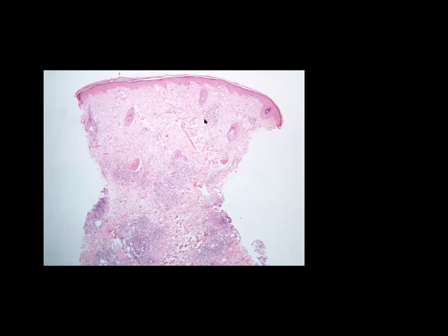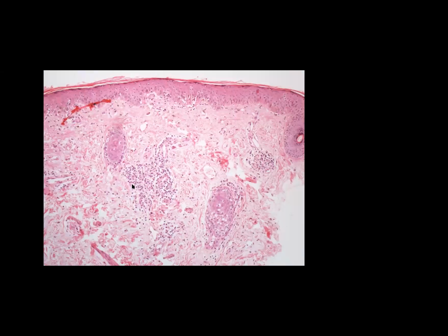We can see this perivascular and periappendageal infiltrate in the superficial and deep dermis. On higher magnification, we can again appreciate this vacuolar interface change, thickening of the basement membrane zone, dilated ectatic vascular channels, and again this lymphocytic infiltrate around the appendages and the vessels.